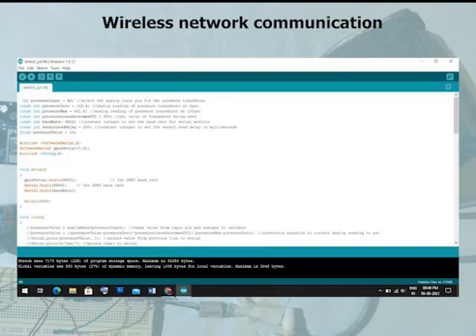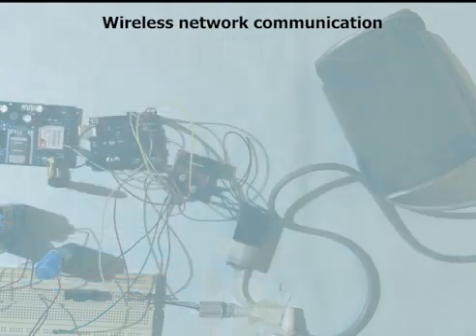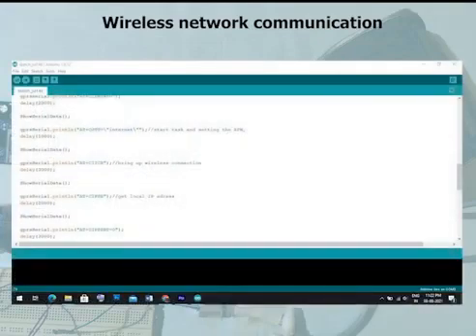The obtained pressure sensor value is stored in a variable called pressure value. To push this value onto the cloud server, we need to establish a network, that is in our case a GSM 2G network. To establish this network, we make use of AT commands which are used to establish network using cellular device. After all the necessary commands are called, an APN is set up to enable cellular connection. In our case, we are using an IDEA SIM card, thus the APN for IDEA is called as Internet.